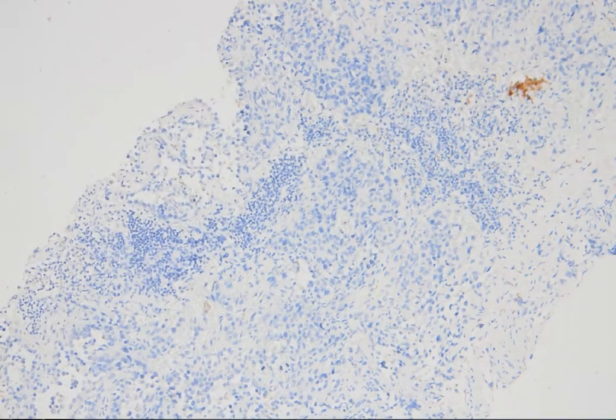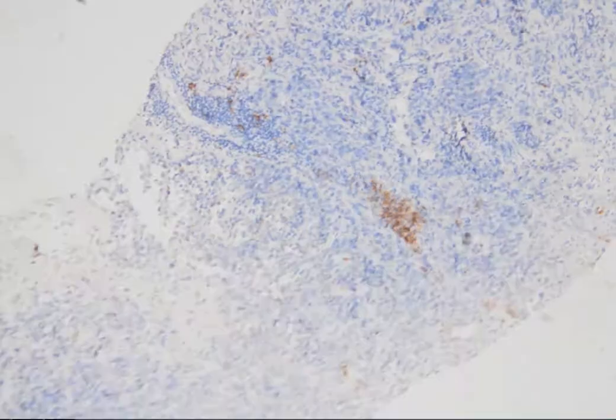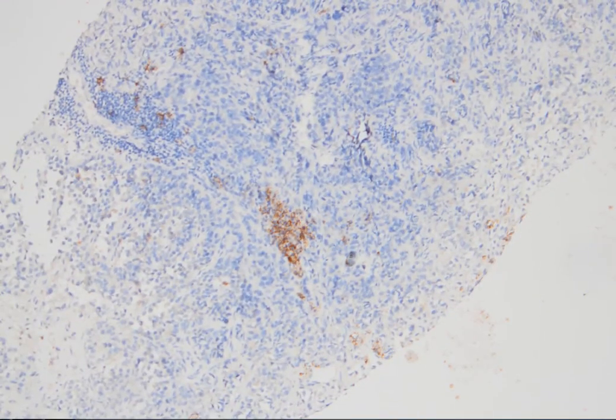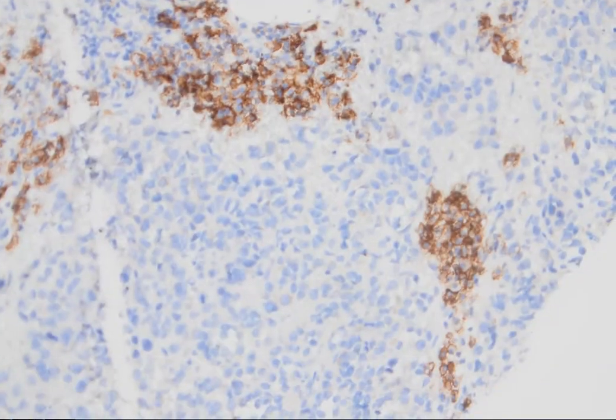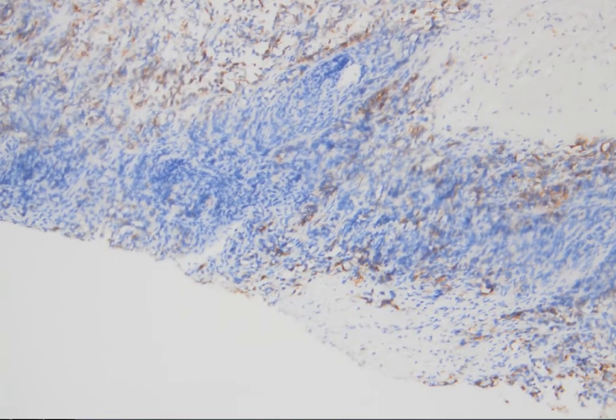I ordered some stains like cytokeratin, and it was negative. And since I know this is an adrenal tumor, and we have this adrenal tumor in this patient, I also ordered EMA. EMA is focally positive. Okay, focal. And I ordered synaptophysin. Synaptophysin was positive, as you see here.